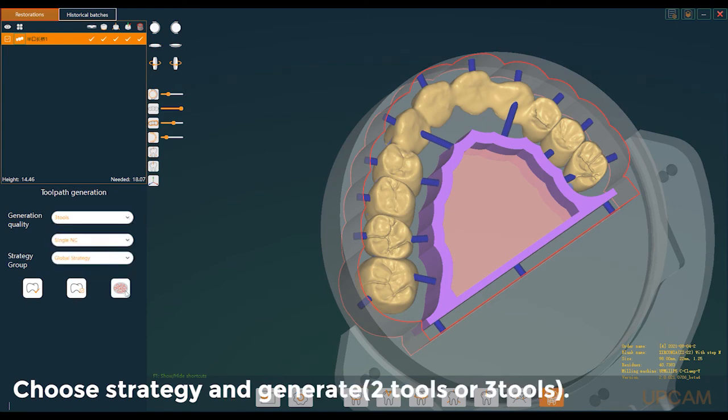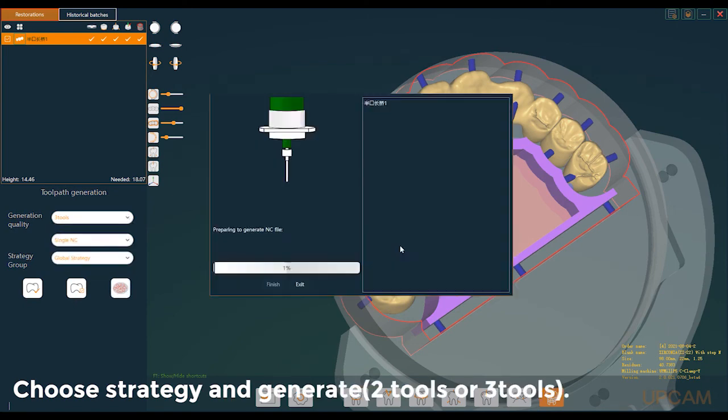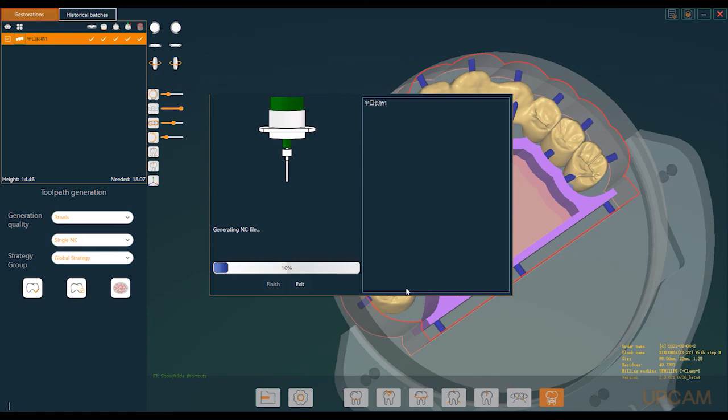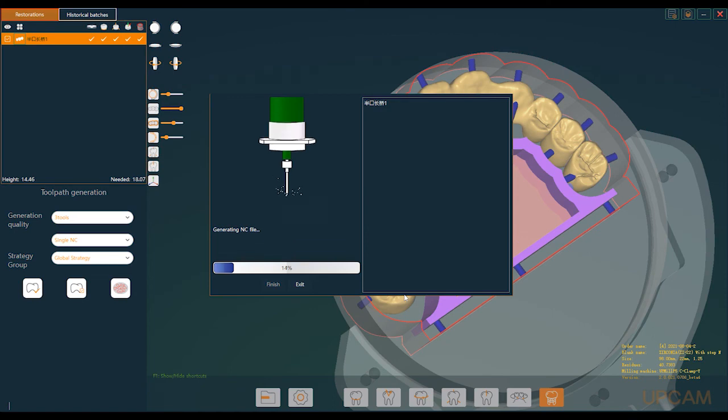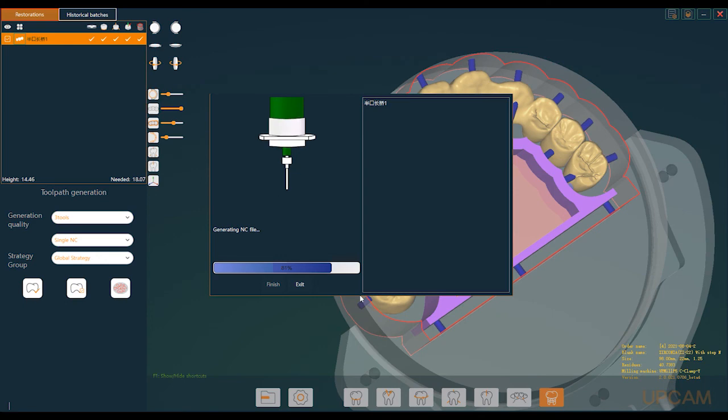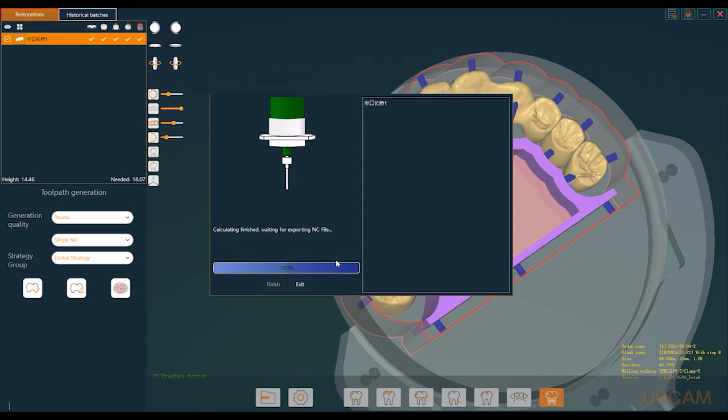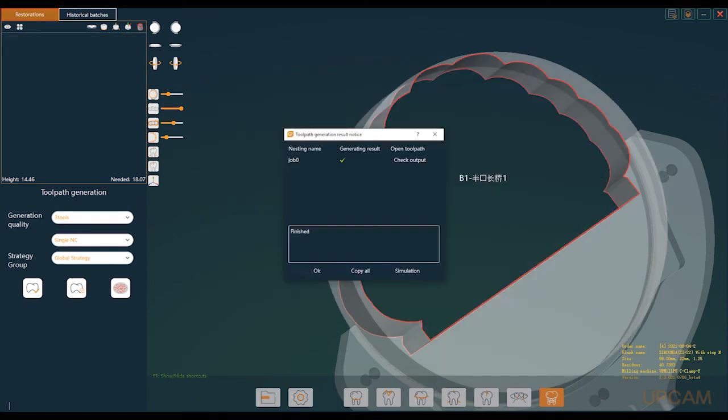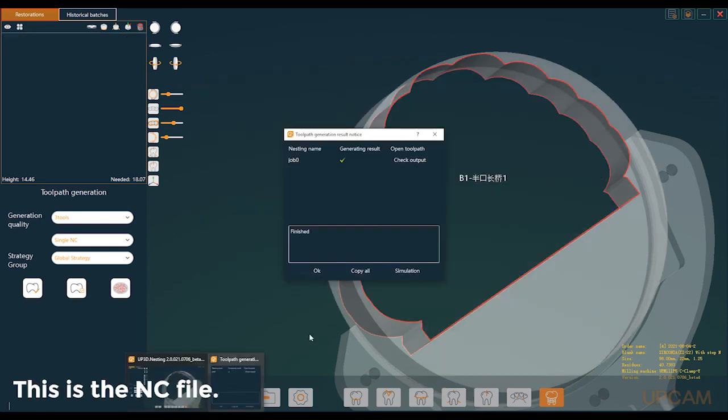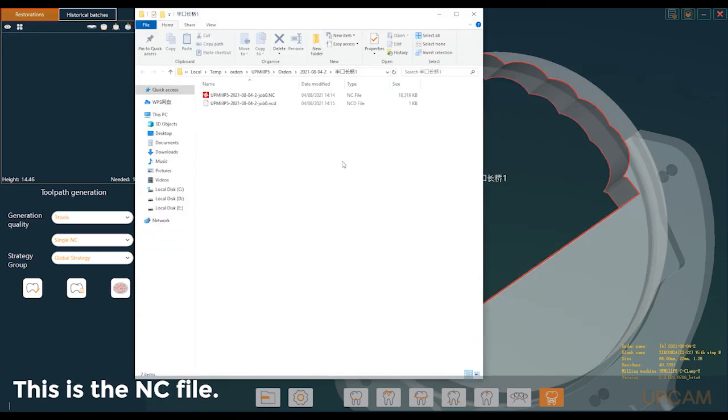Choose strategy and generate. This is the NC file.